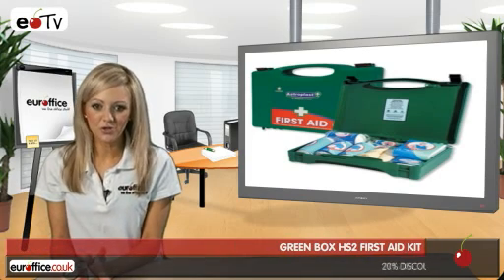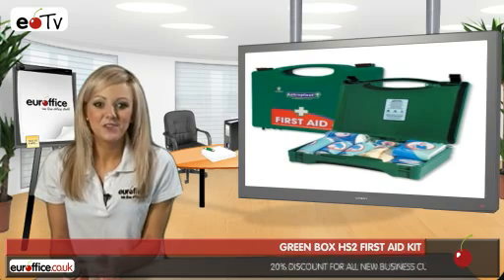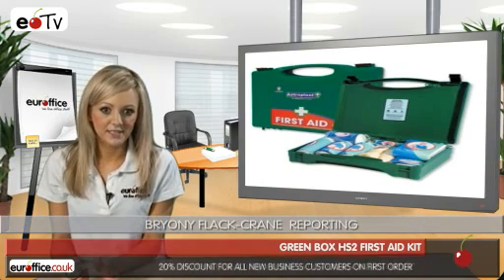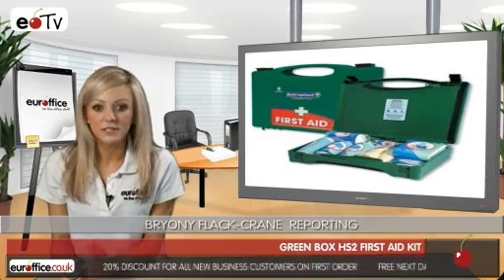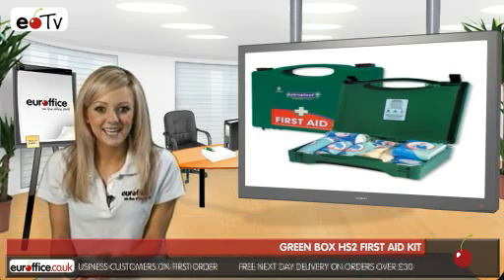Now, no matter how safety conscious you are at work, accidents are going to happen, so it's best if you equip yourself with the Green Box First Aid Kit. It's a perfect size for offices which have around 20 people working in them, so let's see what you get included in your Green Box First Aid Kit.